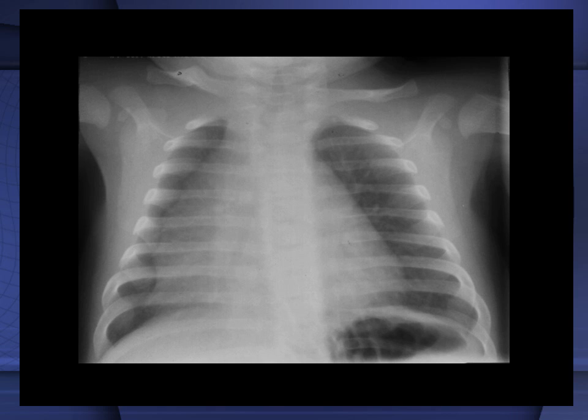Let us examine this chest film. And if you look at this chest film, is there something abnormal about the cardiothoracic ratio in this patient? If you guess that it is normal, you are correct. First of all, you need to realize that this is not an adult patient, but it is a child. We can visualize this or interpret this by looking at the funnel-shaped thoracic cage, and if we look at the heads of the humeri bilaterally, they are not yet ossified.